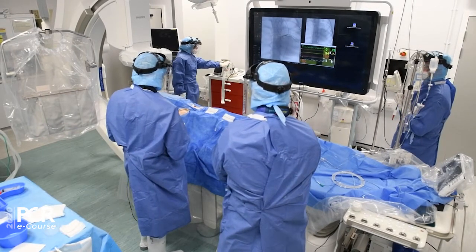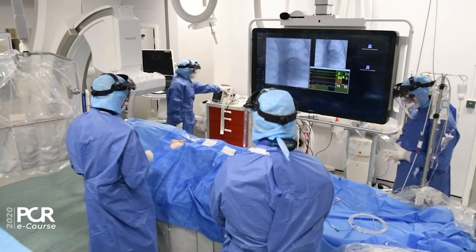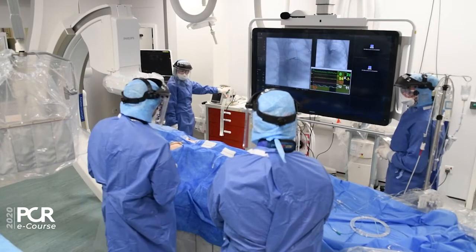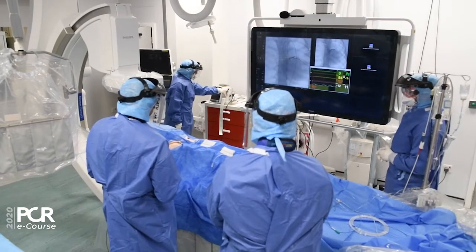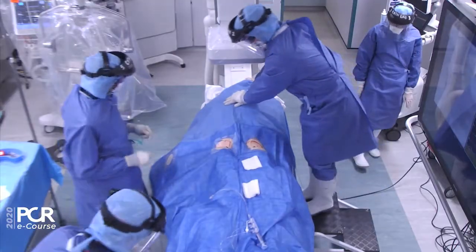Everybody clear? Shocking. Still VF. Okay, shock again. Ready for charging. CPR. Ready. Everybody clear? Shocking. Still VF. Okay, CPR please. Oxygen back on.